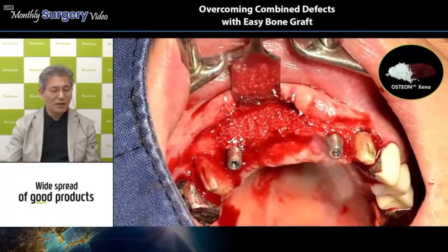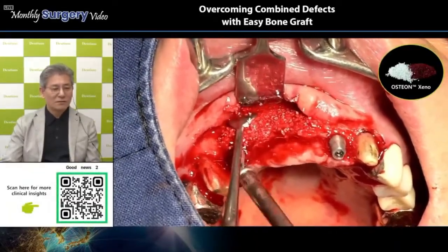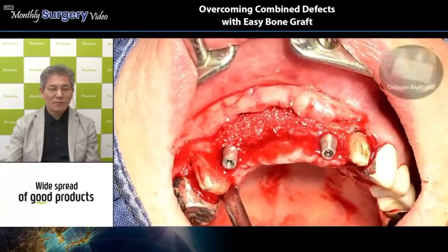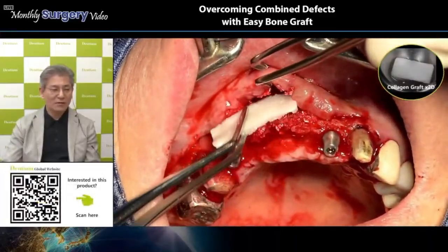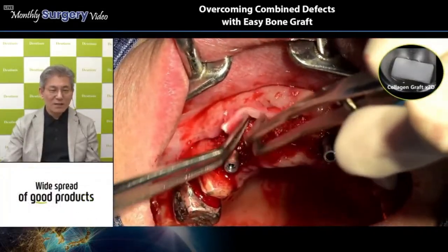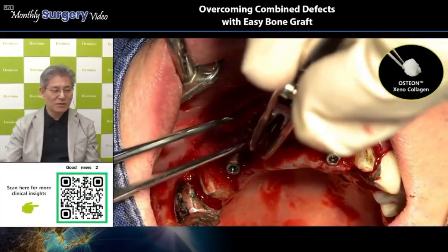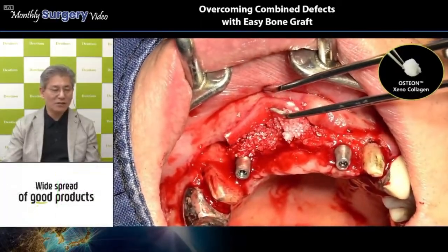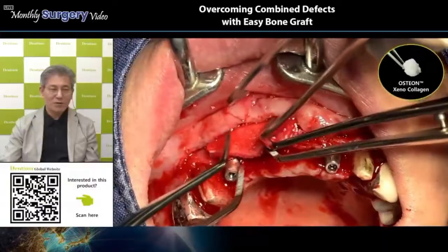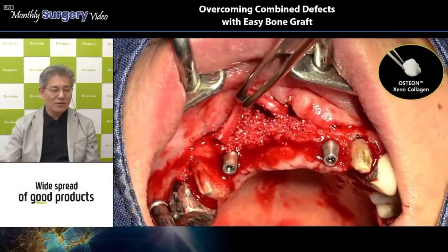So the packing is a little bit dense around this implant fixture. Ordinarily, 2 millimeters of bone from the outer surface of the implant fixture is a necessary part to make a long-term successful result. That is a very general principle. Especially on this anterior, it is an important factor to maintain a well-conditioned site after insertion of the implant fixture. So autogenous bone first, then the xenograft on the outer surface, and finally we are going to make the minimum 2 millimeters sustained in this area.